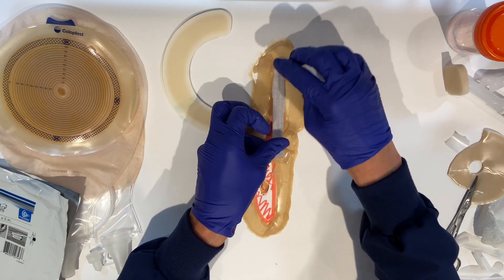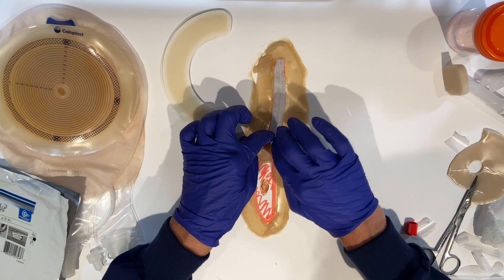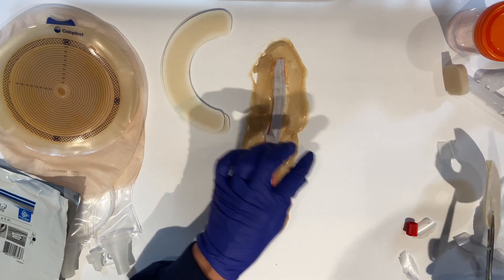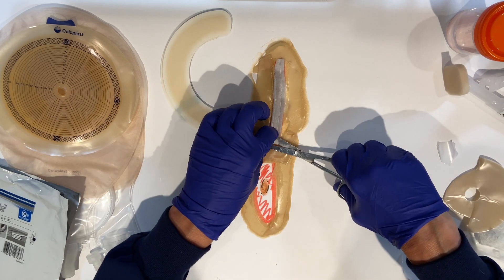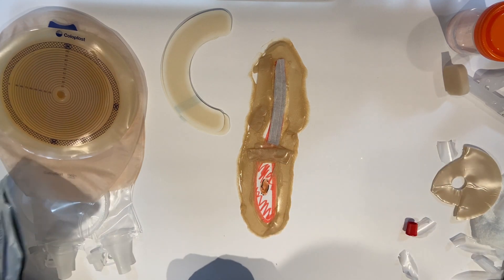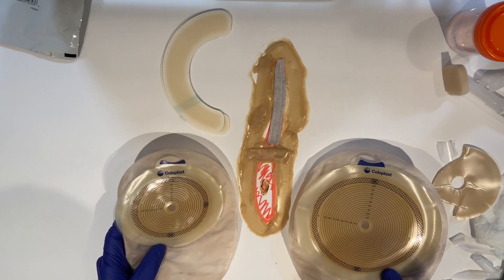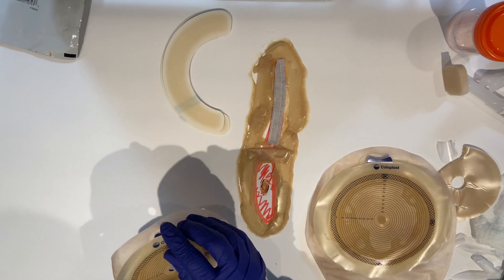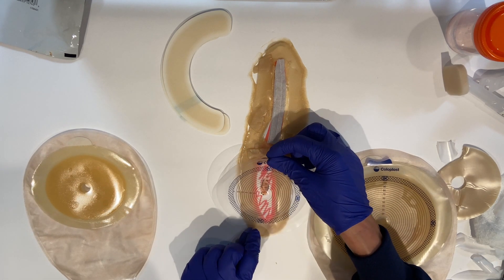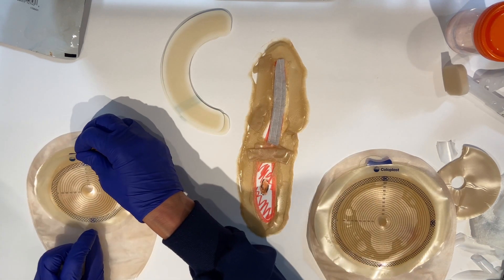Now we want to treat that wound on the upper part, so we're going to put our silver dressing right into the wound. Sometimes I put it in dry, sometimes I pre-moisten it — it kind of depends on how the wound is acting before I get there. His wound was more wet so I'm putting this guy in dry. Now we have to decide on pouches. He's kind of right on the fence, but if I measure him for this pouch I won't be able to see the barrier rings at the top and the bottom, so this one is out.